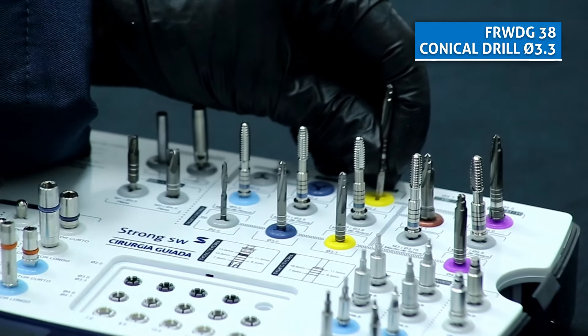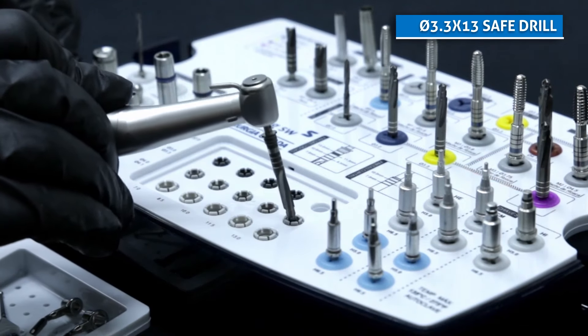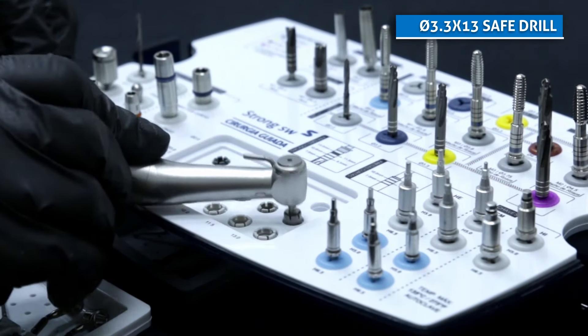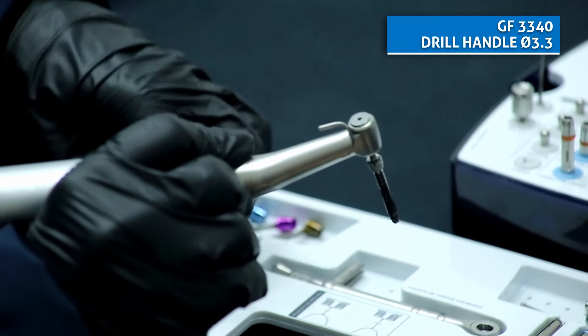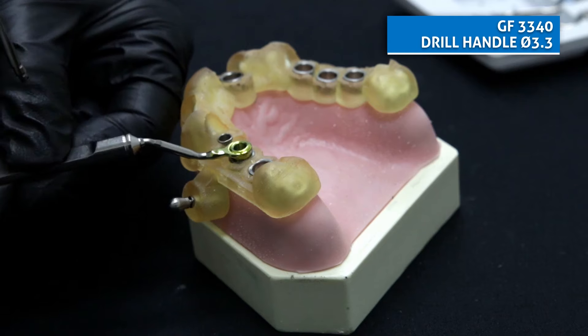Then we go to the conical drill 3.3. Fit it to the hand piece, select the safe drill stopper 3.3 per 13mm. Select the drill handle 3.3. Fit it to the guide sleeve and repeat the drilling.